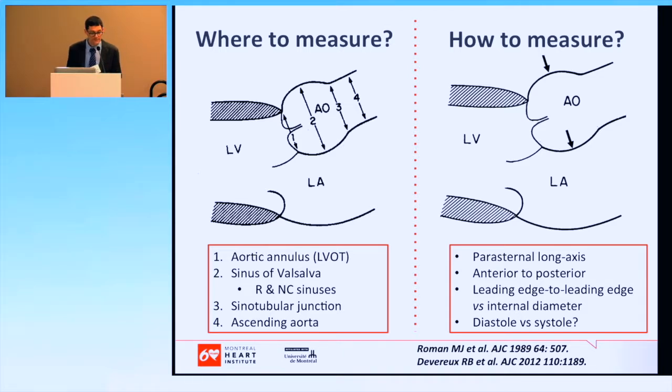Echocardiography normally measures the aorta from leading edge to leading edge. That's a measurement technique that's still used but inherited from M-mode imaging, which we're not using anymore. There's also been a trend during the last 10 years or so to use the inner edge to inner edge diameter. But that can make a difference in the measurements, although the most recent echo guidelines have gone back to the leading edge to leading edge.